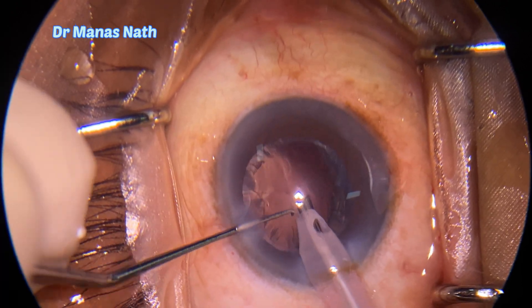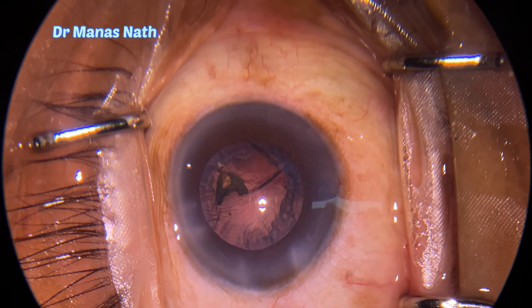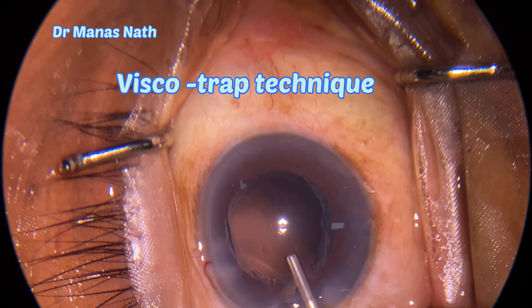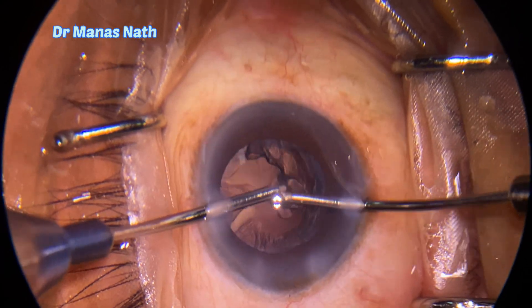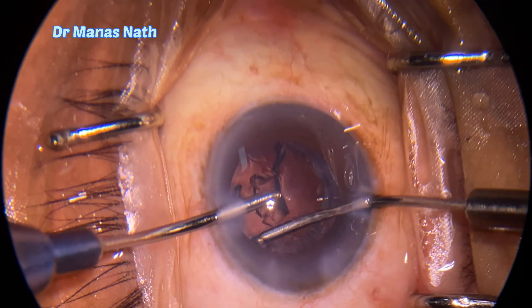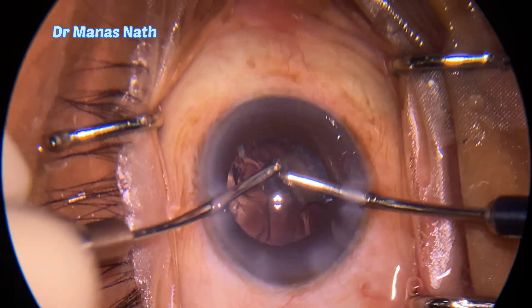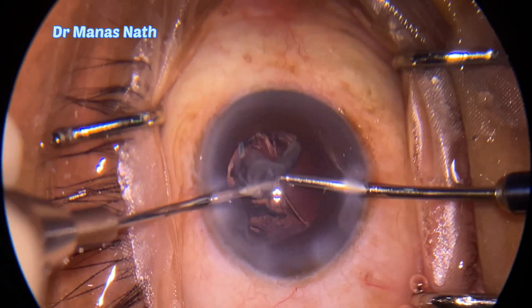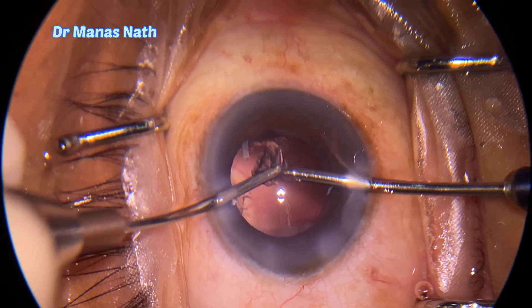Here's the last piece. While initiating my irrigation-aspiration, you can see there is a chunk of epinucleus, so I decided to remove it with viscoelastics only, because otherwise the bimanual irrigation-aspiration may clog the aspiration tip, or broken pieces of epinucleus can hide under the iris and cause problems postoperatively in the form of recurrent iritis or CME.